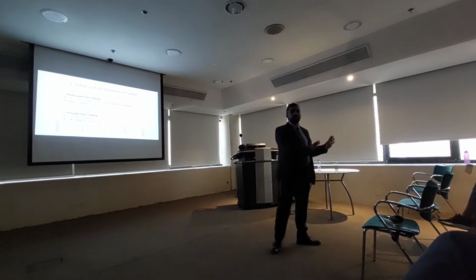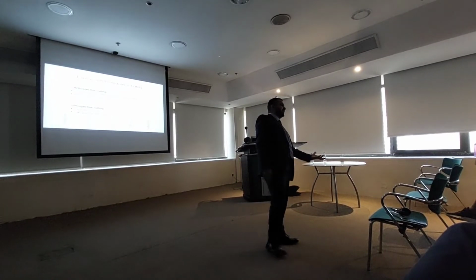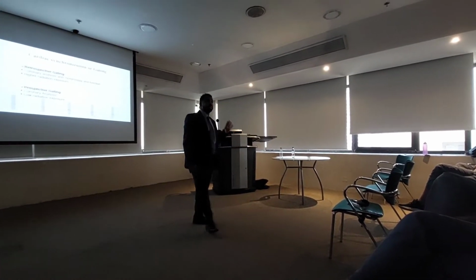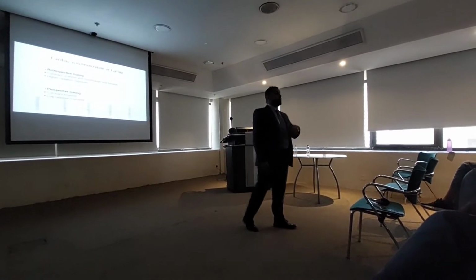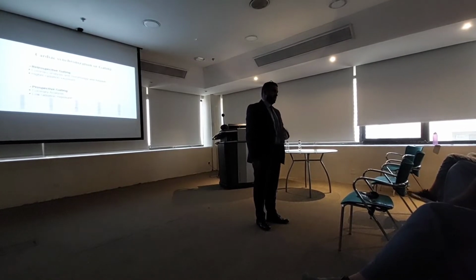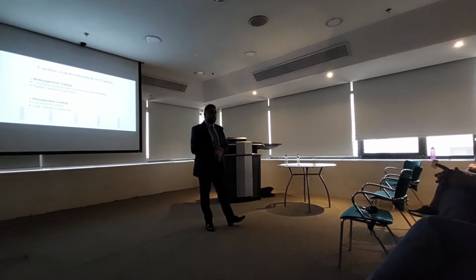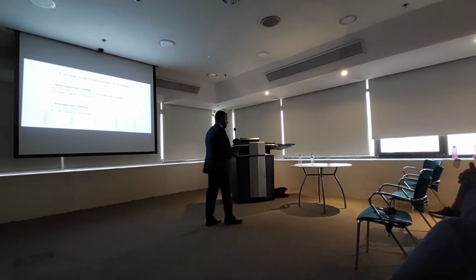this is a good candidate for prospective gating. Why is that? Because I need to reduce his radiation dose. This is the only benefit, the main difference. Cardiac CT scan is high radiation, so that's why you need this. He's eligible now, so you will do your best, first do the prospective. Otherwise, usually you should do more than 80% of your cases prospective. This is a must, we hope for all patients.